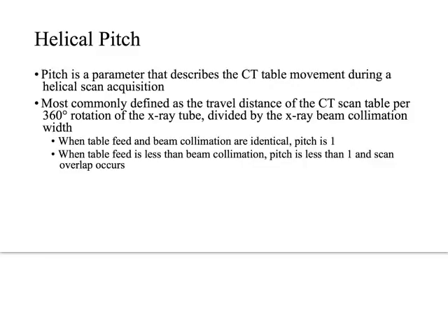So pitch is going to be the parameter that defines the CT table movement during the helical scan acquisition. Okay? The most commonly traveled distance of the CT scan table per 360 degree rotation of the tube will be divided by the X-ray beam collimation width. I know I just said a whole lot, but basically if the amount that the table moves is the same as the width of that slice, the pitch is 1.